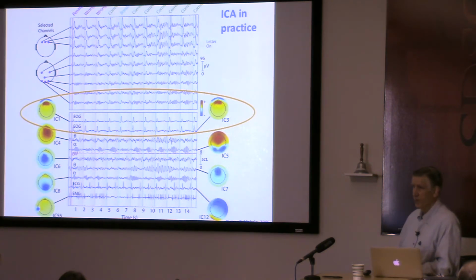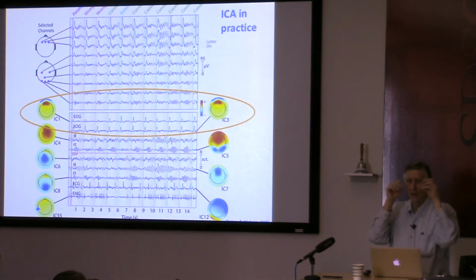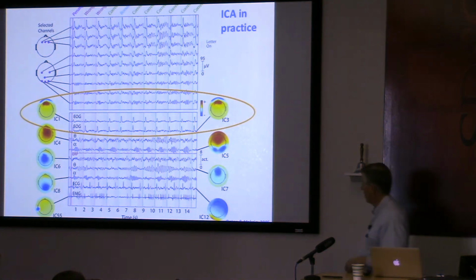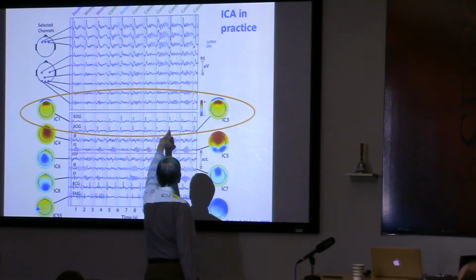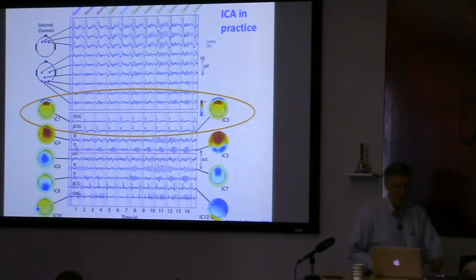It should be slightly different. And if you back projected, we multiply those time courses by those maps and made a movie of the result, what you should see is something accounted for by the fact that when you blink your eyes move up slowly. They move up, and apparently it moved up slowly here because this component is always slightly before that component, but not distinctly. So that means they're not actually temporally independent.